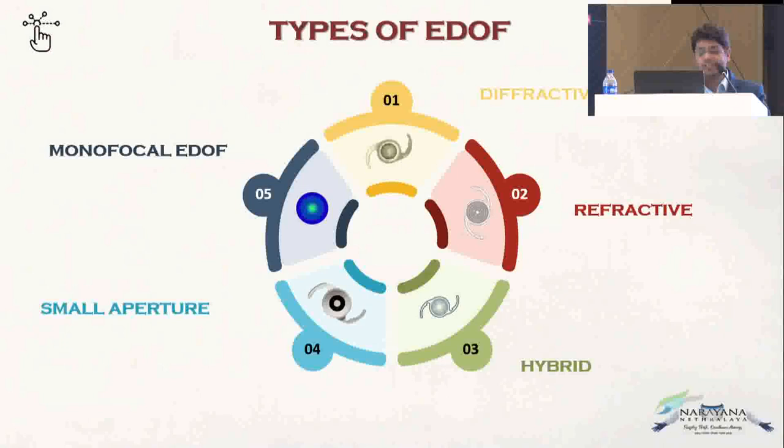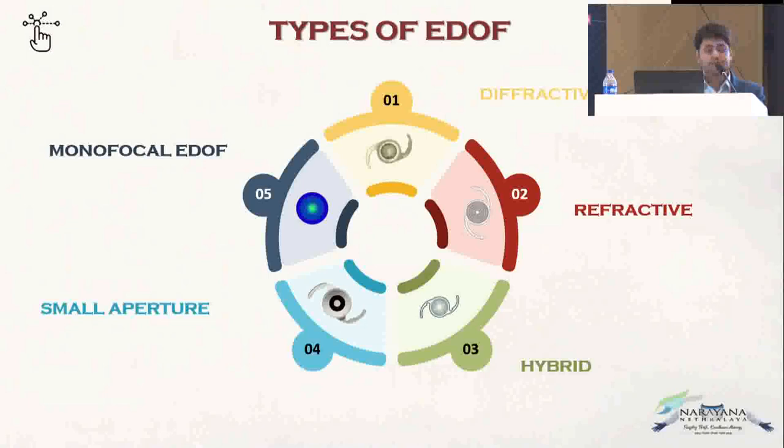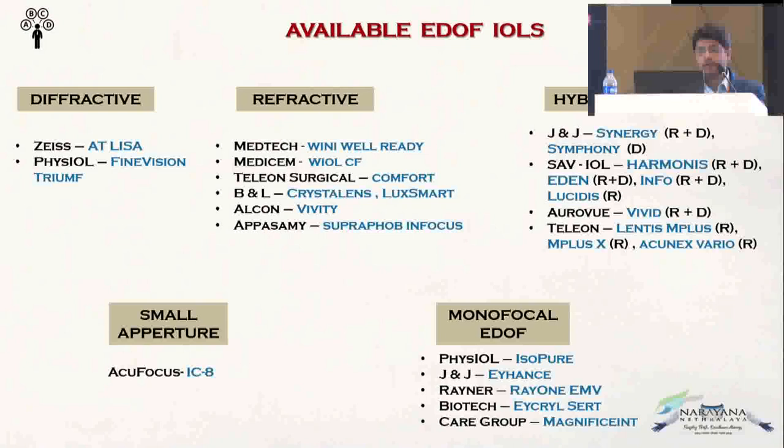So if you look at the chart now here, can you go back, Dr. Anuj? The previous one, yeah. So like I was mentioning about diffractive and refractive, right? If you look in this bracket of lenses, the diffractive and hybrid are actually just diffractive, finished. It's just one. It has those rings, so that means it's diffractive. And then non-diffractive, it comes into all these enhanced monofocal, small aperture, refractive. All these are non-diffractive. So this way you can make it much more simpler in terms of classification. Please go ahead. These are the different IOLs that we have available in our entire armamentarium based on the mechanism with which they act.